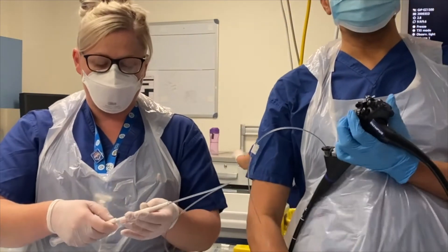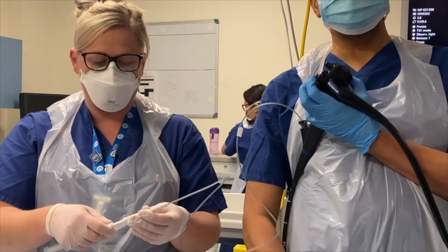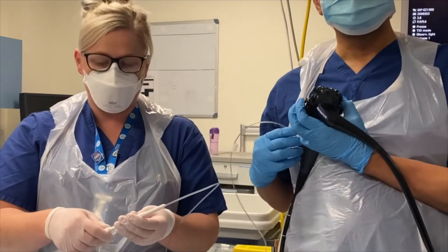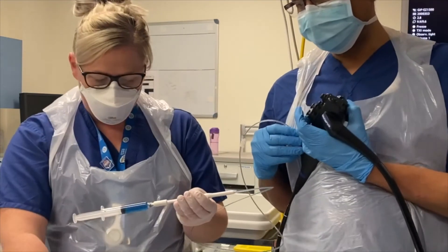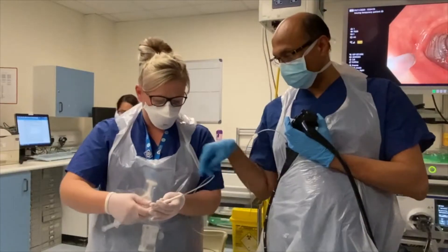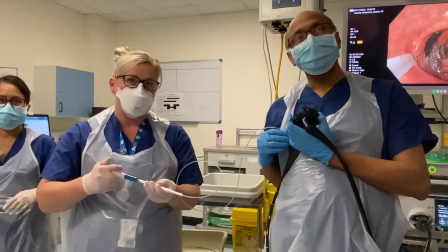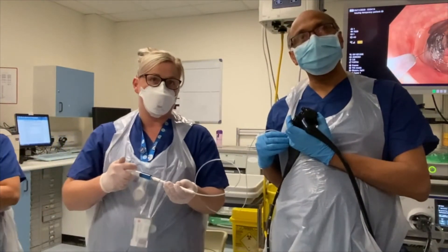Now we will do exactly a similar tattoo on the other side. Can we empty the catheter first? Yes, inject — so that we get all the tattoo out.